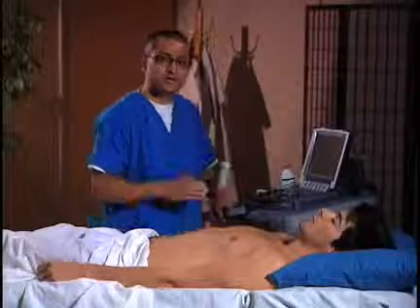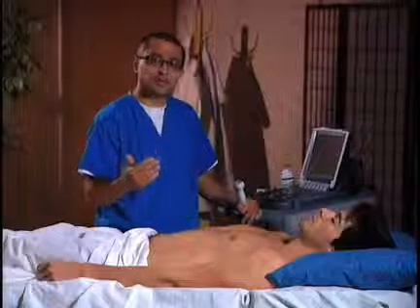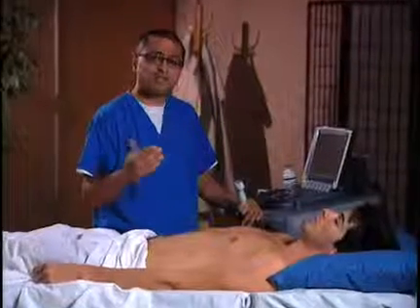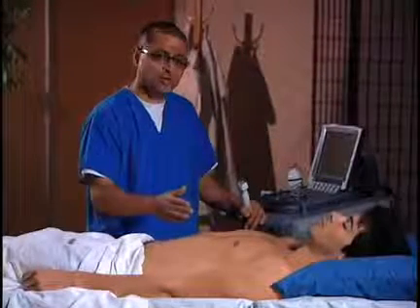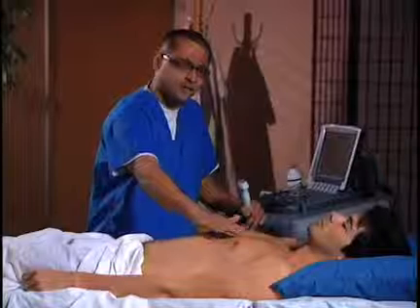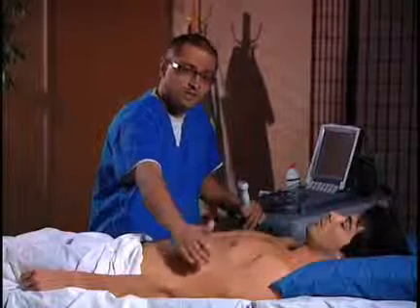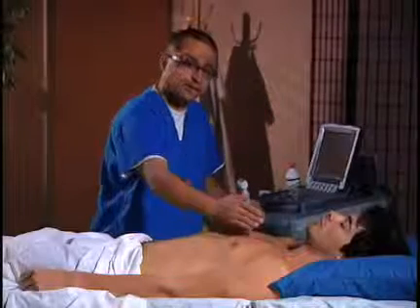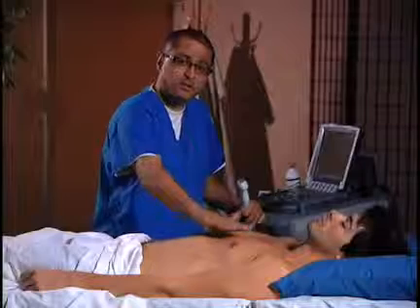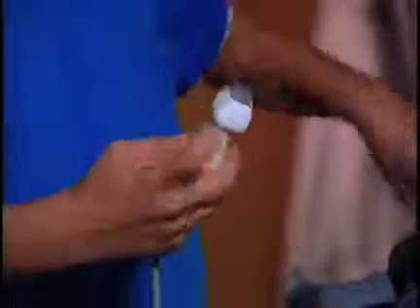Now, the area that we're going to scan is an area where we expect air to collect in the presence of a pneumothorax. That would be the most anterior aspect of the lung. So if you look at our model right here, we would expect air to collect more likely in the anterior surface than more posteriorly. Therefore, when I do my scanning, I'm going to scan about the mid-clavicular line at the most anterior area of the patient's body. So we're going to go ahead and start scanning.